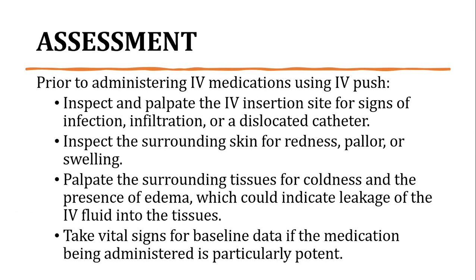The assessment phase. Prior to administering intravenous medications using IV push, inspect and palpate the IV insertion site for signs of infection, infiltration, or a dislocated catheter.